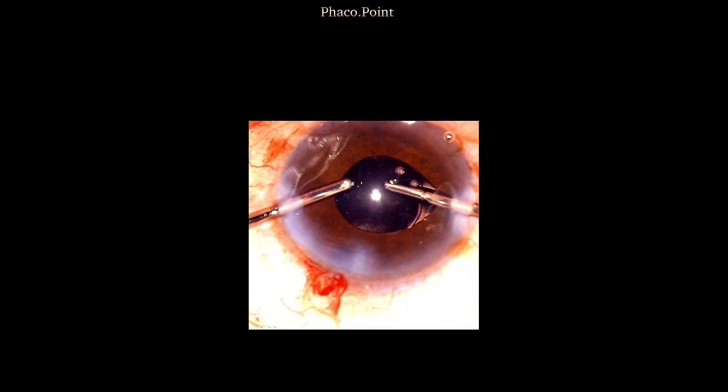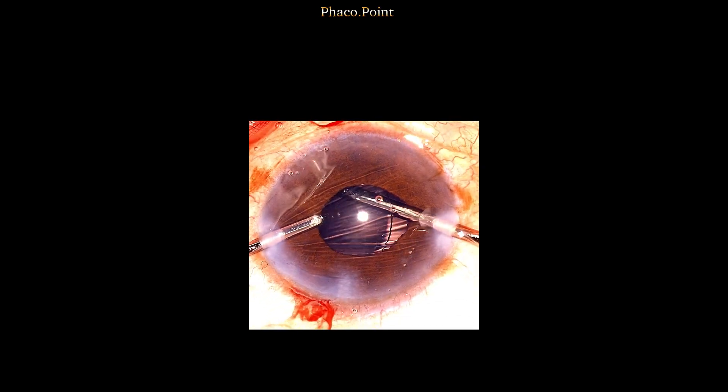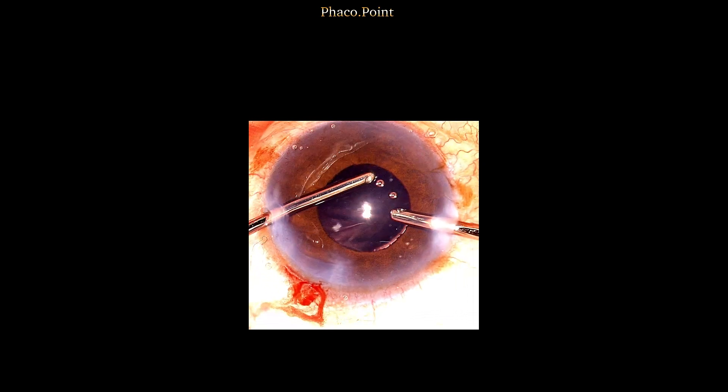The optic edge is then identified and with the tip of the irrigation cannula, it is lifted up. The irrigation cannula is passed under the IOL and the irrigation aspiration is used to wash out the viscoelastic from behind the lens.